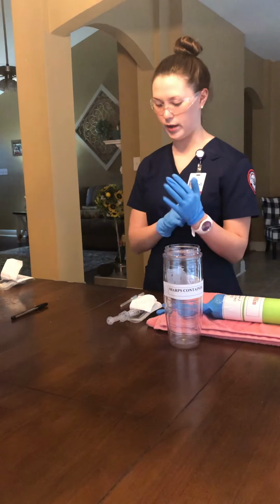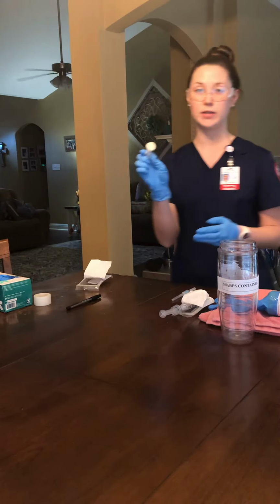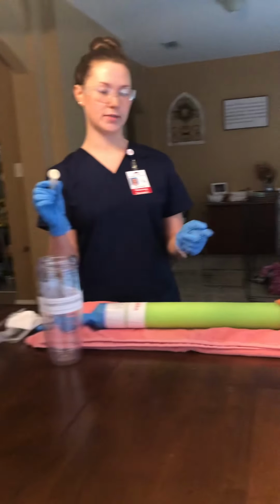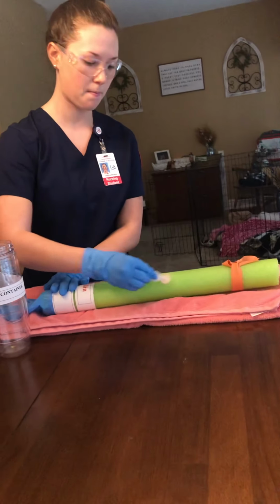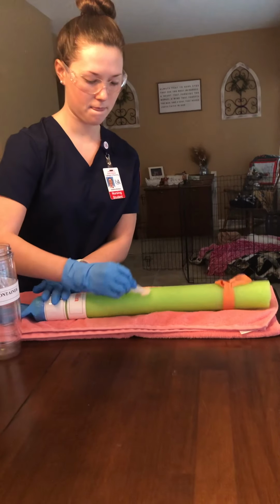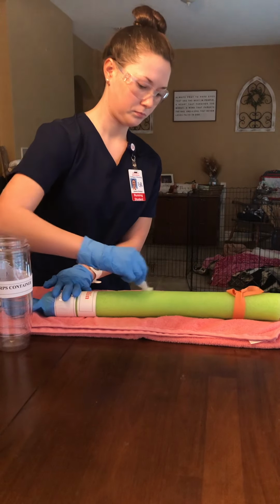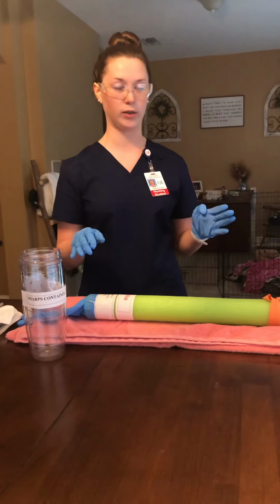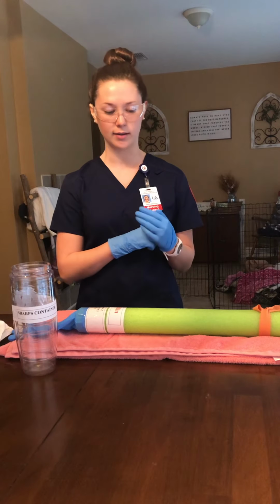So the next thing I want to do is clean with chlorhexidine. I would squeeze this to activate, and then I'm going to clean the site using friction, going horizontal, vertical, and circular for 30 seconds. So once I get that clean, I'm going to dispose of that. I'm going to wait for it to completely dry. This time I would not touch the site because it is now clean.